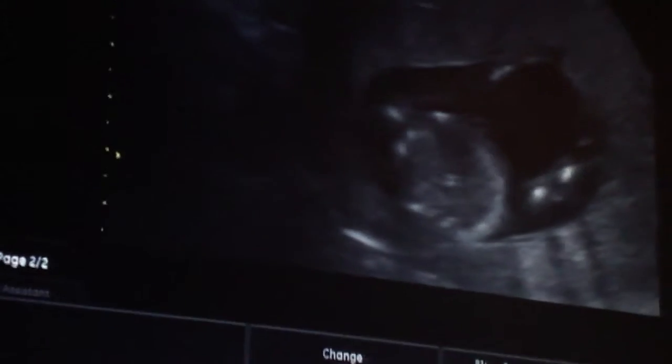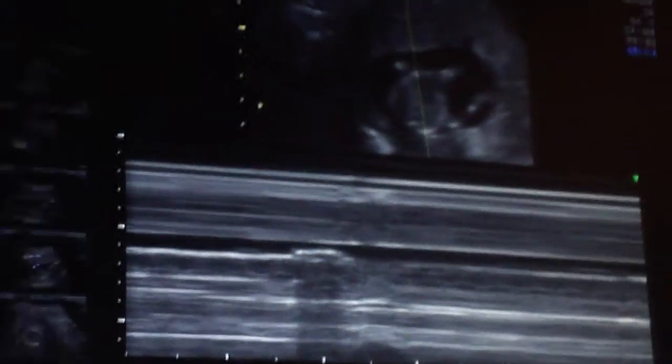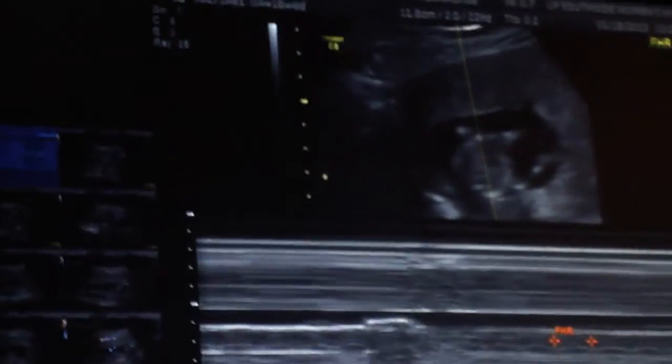You can see the little heart moving. Just going to get a heart rate. 143 is the heart rate, and that's good.